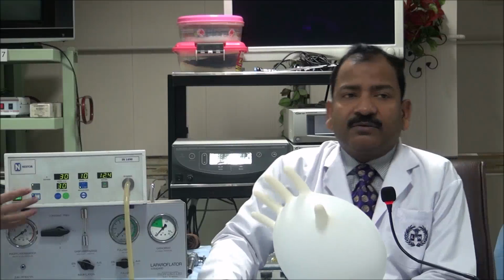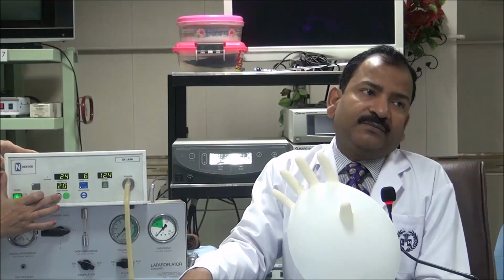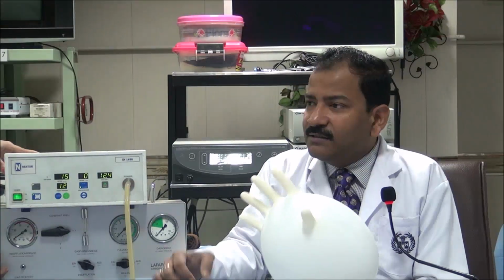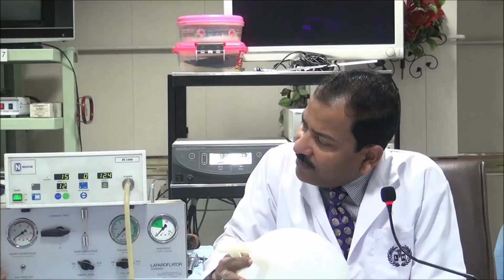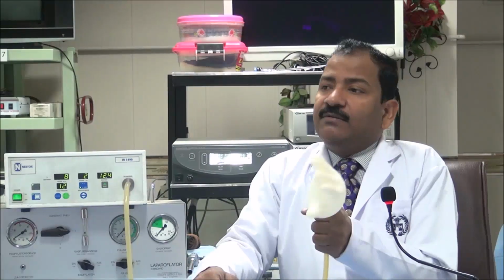Once you put the 12, it will start giving alarm. Why will it give alarm? Because the pressure is more. And then I have to release it. See, after 5 to 6 seconds, I am taking it out. And if it is at 12, it will not deform. So that's why 12 and 15 is the better pressure for peritoneal cavity.